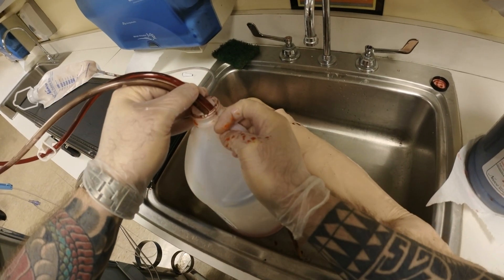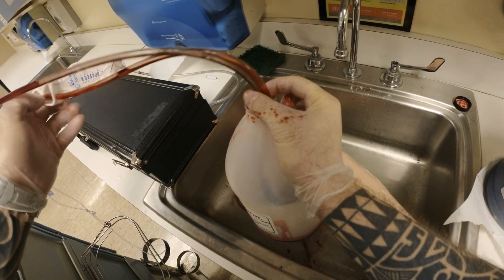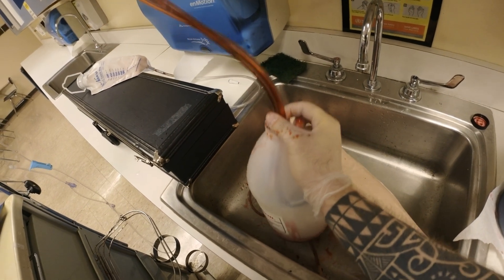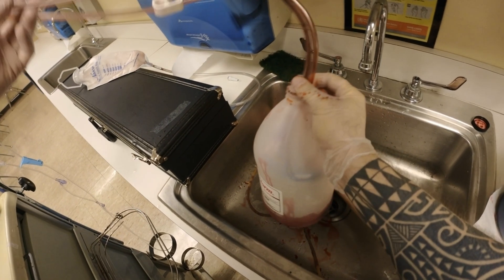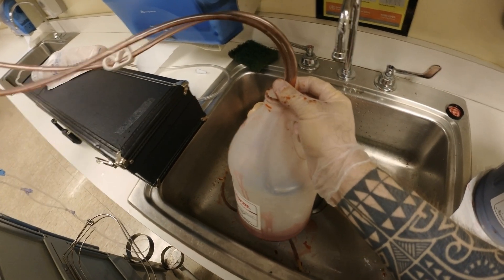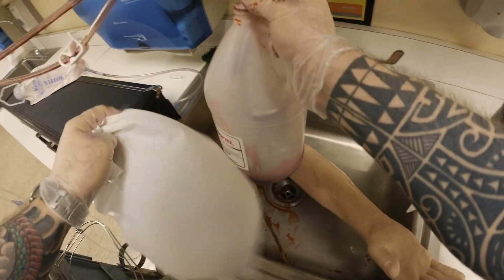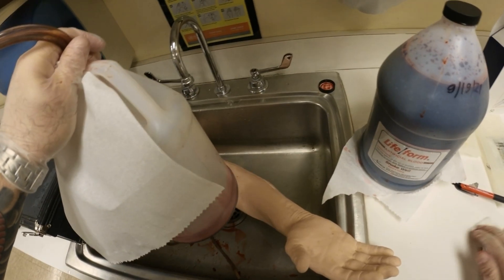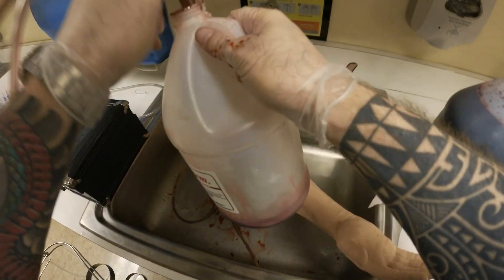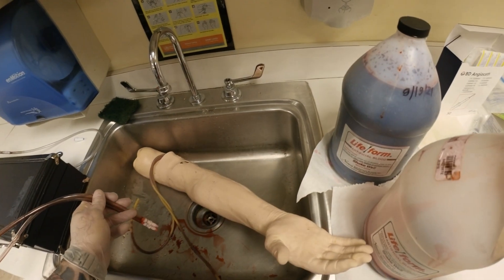I'll show you how we're going to flush it. I want to get all of it — all of it is here. I close my clamps, get some tissue. This is going to be my reusable container.